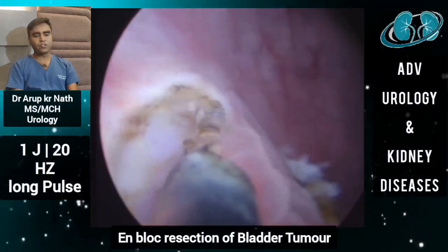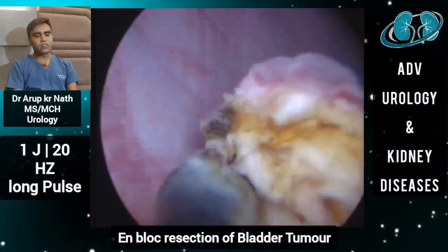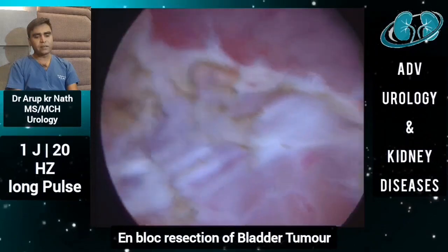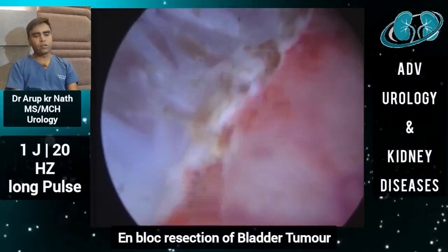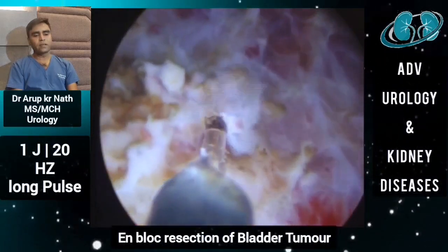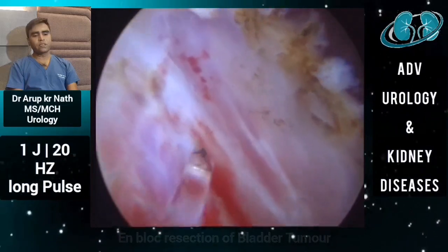This is the completion of the procedure — you can see the whole tumor, such a large tumor, so beautifully taken out from the tumor bed. You can see the detrusor muscle all around with no bleeding at all. A few pinpoint oozing sites, if seen, can be coagulated immediately with the same laser setting of 1 joule and 20 hertz. Once we are satisfied with hemostasis, we will change the scope for morcellation. Any residual oozing can be stopped with activation of the laser fiber at the same energy setting.